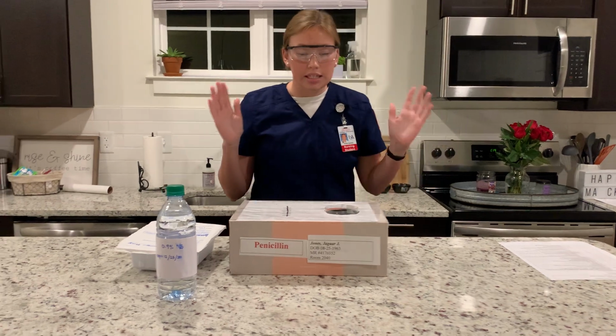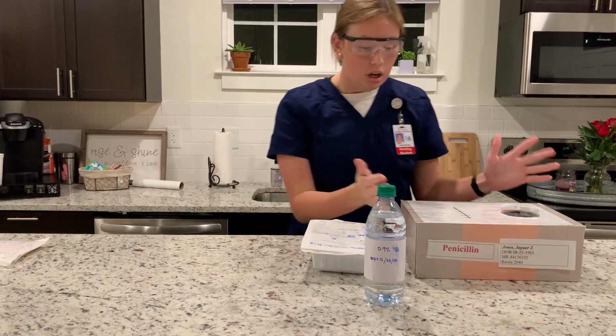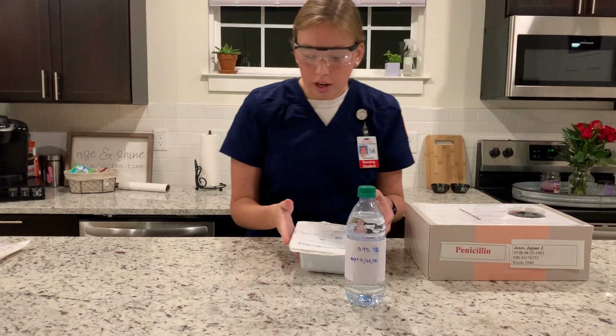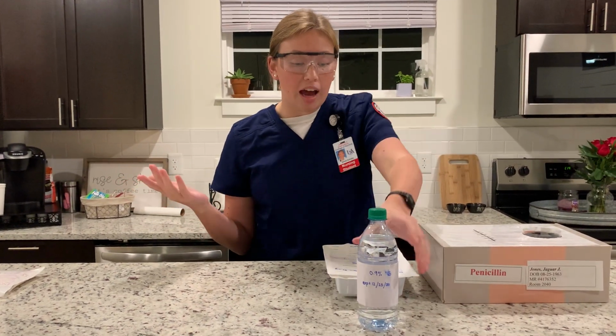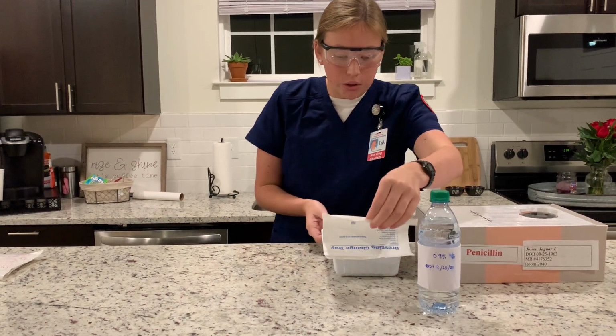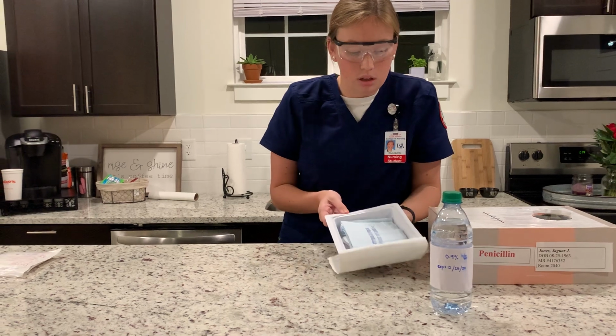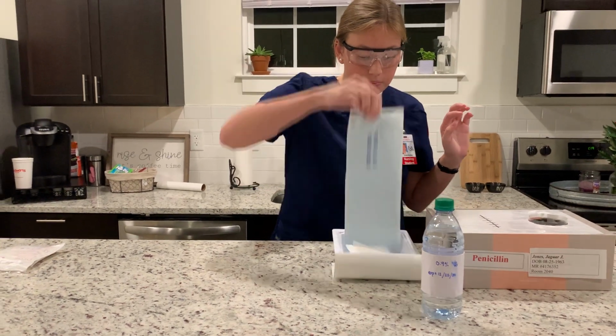Okay. Now I am going to plan my sterile field. I'm just going to move everything around a little bit because I want to make sure I have enough room to have my sterile field and not contaminate it in any way. Now I'm going to open my sterile kit and I'm going to get out my sterile field.